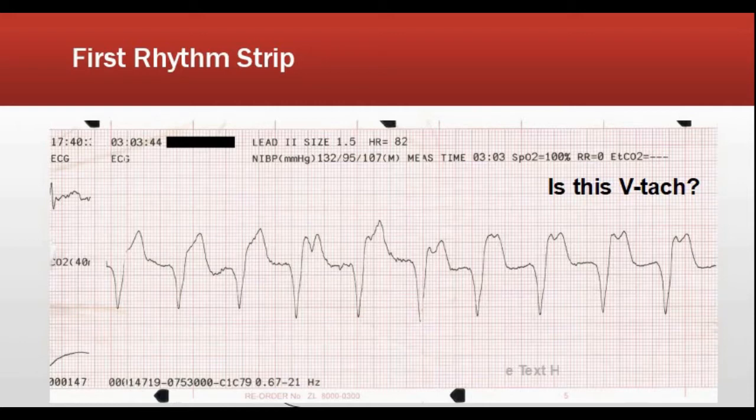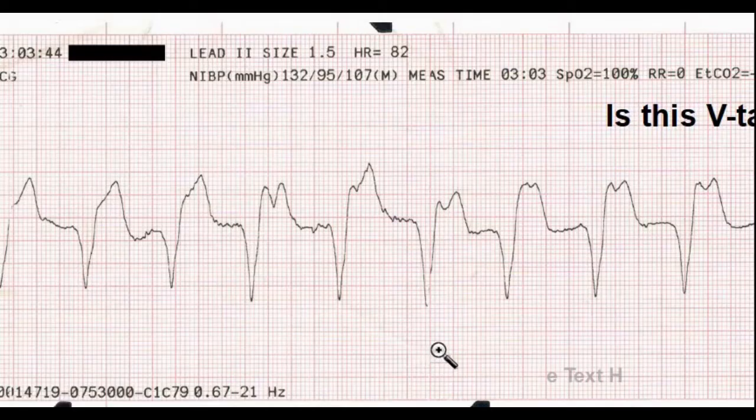And it's also important for us to monitor for any changes, so we need to be aware if the rhythm has changed. We have EMTs, AEMTs, paramedics, and CC medics all working here together. Some of us have already reached a conclusion about this rhythm, but I want everyone to be on the same page, and I'm talking to all levels of license here. So let's go over a couple of fundamentals of what paramedics are looking at when we look at this stuff.